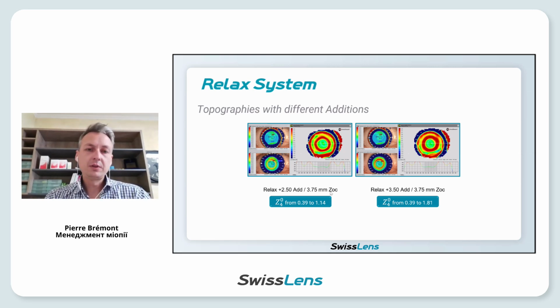The only difference between the left and right is the amount of defocus, the addition in periphery. On your left, you have 2.5 diopters, and on the right side 3.5 diopters. And we see that the spherical aberration is highly impacted by the choice of addition.